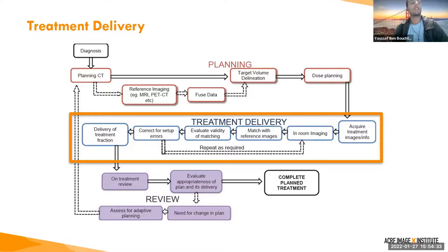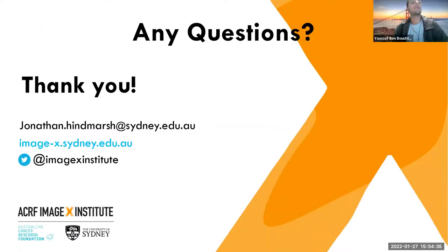James asked the question, does the PTV change with tumor response to radiotherapy? Typically, we do not change the PTV during treatment. Again, in the situation for, say, a shrinking head and neck tumor where we replan, we may redo the target, but for the majority of treatment sites, if the tumor shrinks, we don't shrink the margins. We keep treating the same volume.